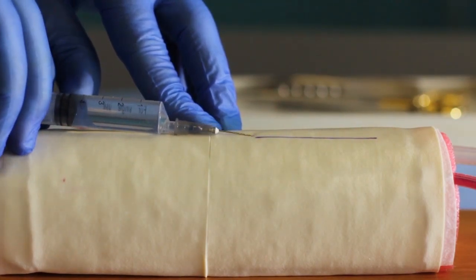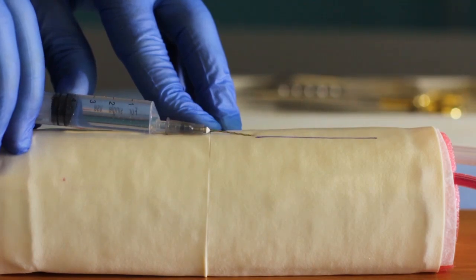With a real patient, you will see blanching. In other words, the tissue will become whiter.